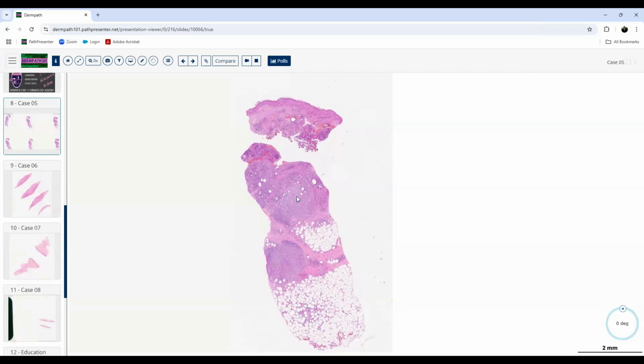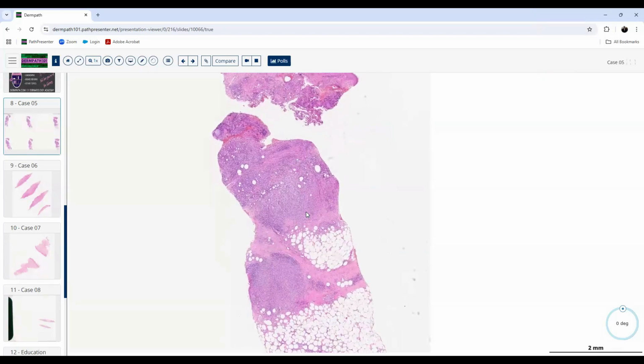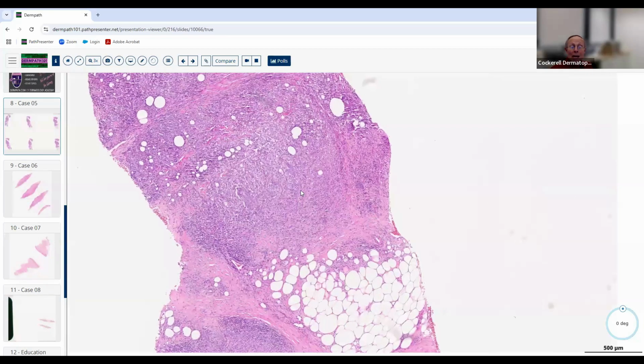More of like a lymphocytic infiltrate. Well, lymphocytes usually are pretty dark also. Maybe like histiocytes. Histiocytes. Good. And if they're histiocytes that predominate, what can you say is the type of inflammation? Histiocytic infiltration. And if we say histiocytes predominate, what do we call that? You said it a second ago. Granulomatous. Good, very good. So histiocytes predominate, granulomatous, nodular and diffuse pattern.